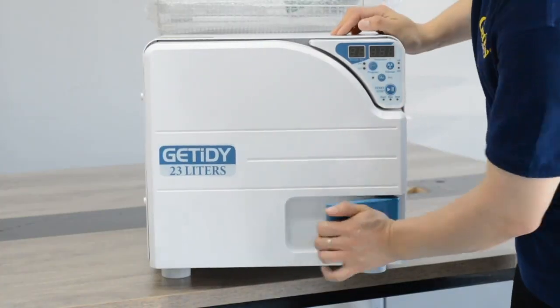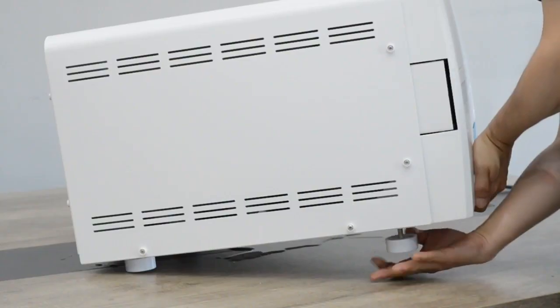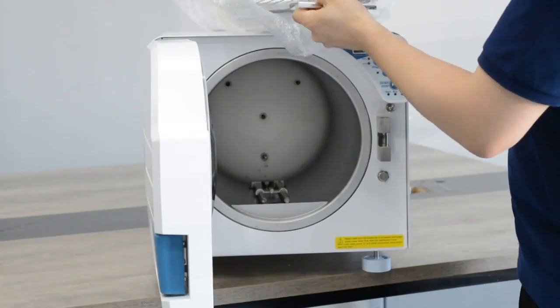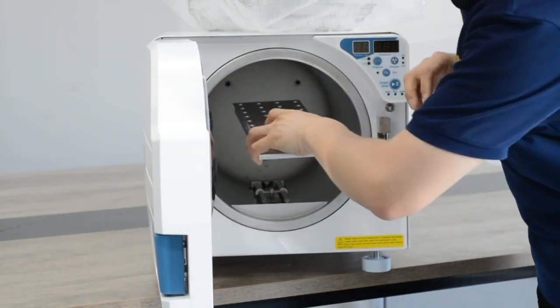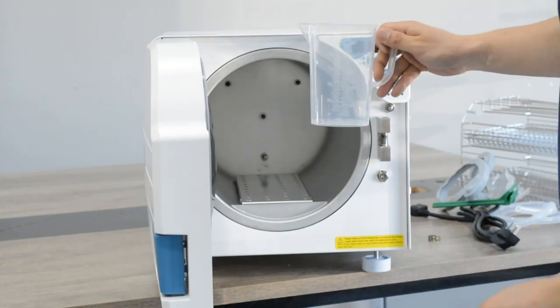Then we need to adjust the two front feet to make it higher. Place the aluminum protective plates above the heating elements. Then add distilled water.